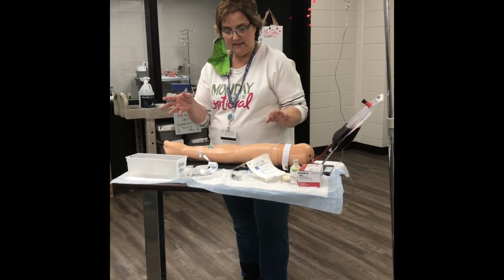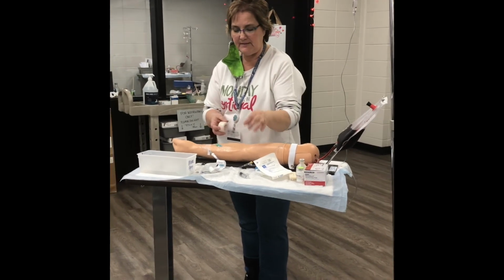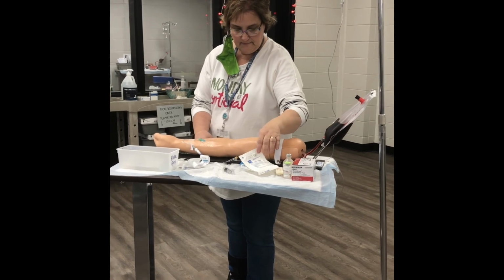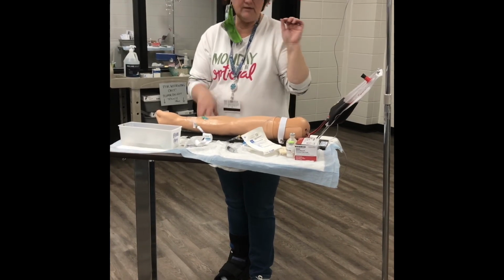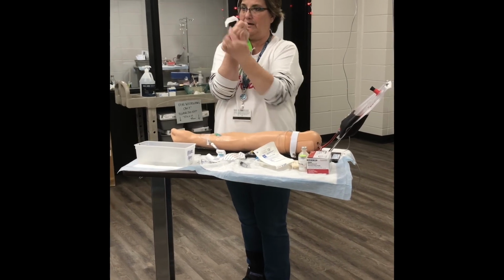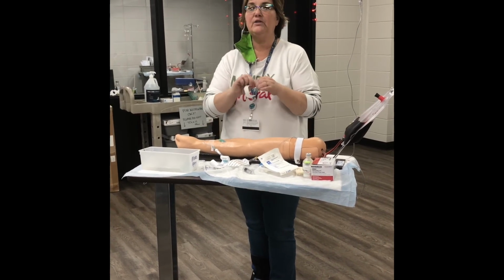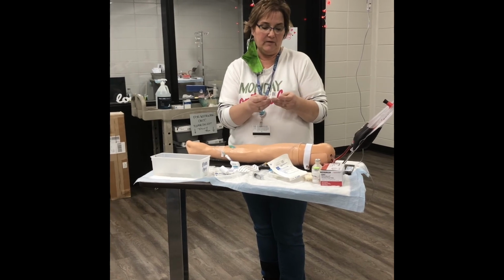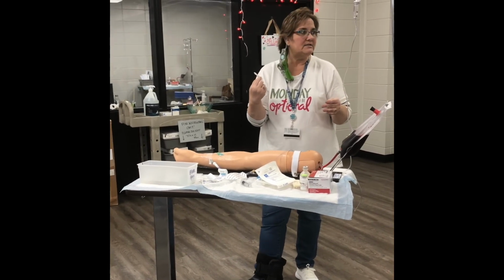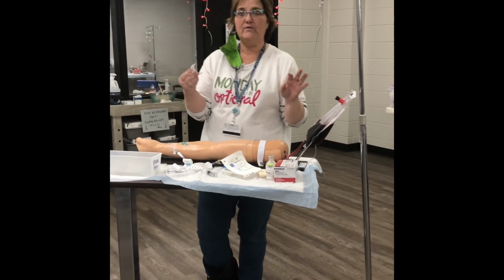All right, so the next day the doctor comes in and says, oh, I almost forgot. In your start kit, there's usually a label, or in this case it was on the edge of my dressing, that you need to label the site, and you just fill in the blanks: your initials, the date, and the gauge. That way the person that's discontinuing it will know how long the catheter has been in.